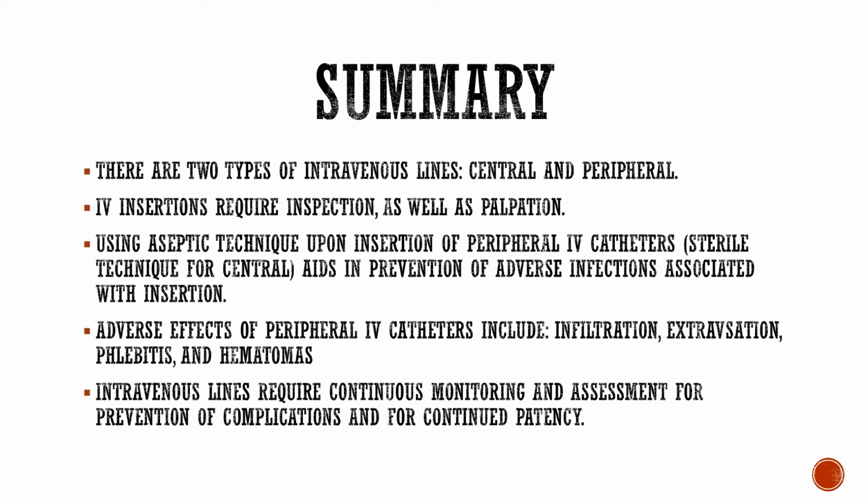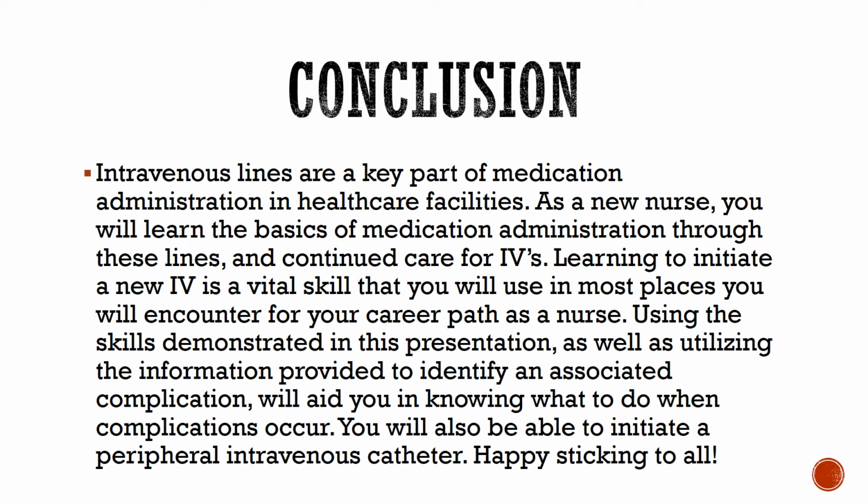Adverse effects of peripheral IV catheters include infiltration, extravasation, phlebitis, and hematomas. Intravenous lines require continuous monitoring and assessment for prevention of complications and for continued patency.